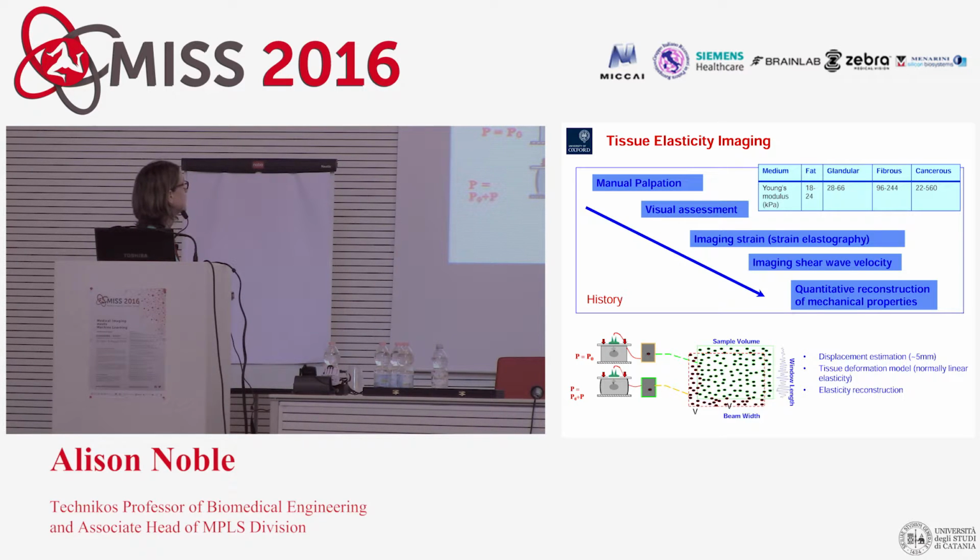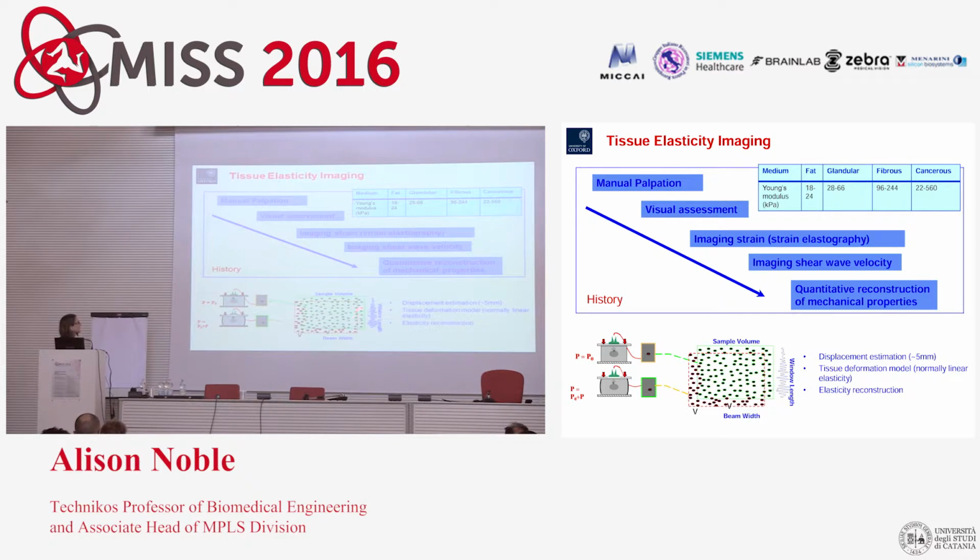The basis of these techniques is simple, illustrated incredibly simply here. You apply a force to the tissue, you increment that force by a small amount, that displaces the tissue, and if you look at the radio frequency signals from the ultrasound, you'll see a shift in the pattern. You can use different ways of estimating displacements based on window-based techniques, and in particular, this is where that speckle pattern comes into its own, because the speckle pattern relates to scatterers, so you have a really nice signature to be able to estimate displacements very accurately.